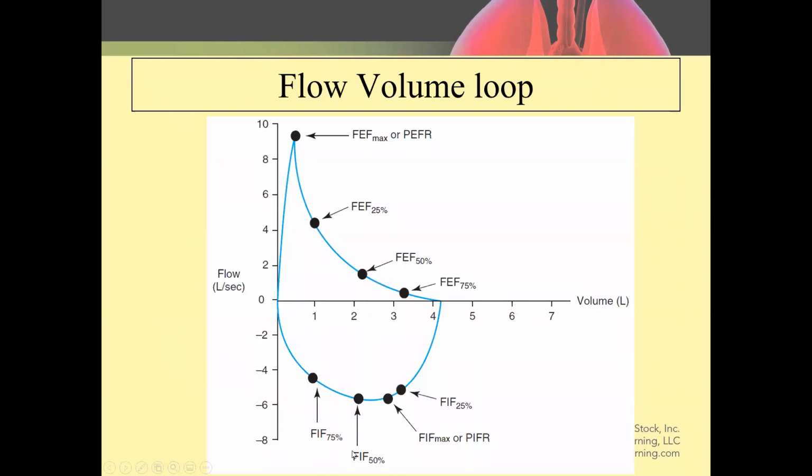Another example here. There's a little more graphic where it's actually showing you where FEF 25, FEF 50 and FEF 75 are. You can see that this is a flow volume, but a lot of the volume is in fact blown out in that first second, okay, in that first second.